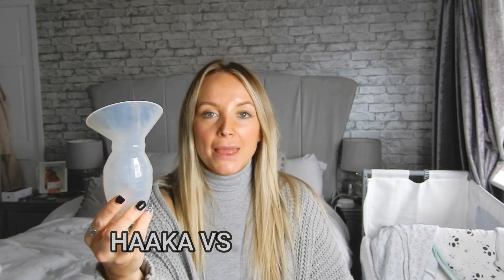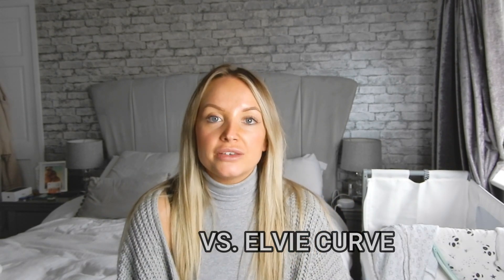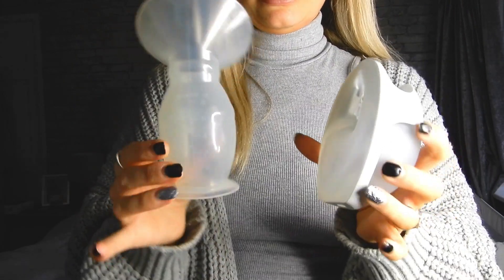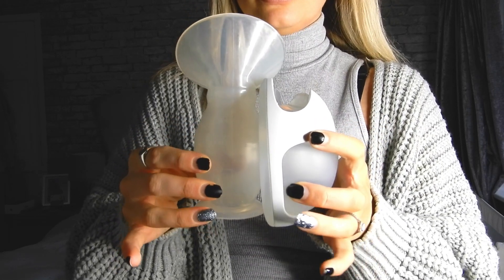Today I am comparing the silicone haakaa and the brand new Elvie Curve. This video is perfect for if you are wanting to breastfeed, if you are already breastfeeding, or if you just genuinely want more information on how both of these work. We have the Elvie Curve and the silicone original haakaa — size difference: the Elvie Curve is shorter.